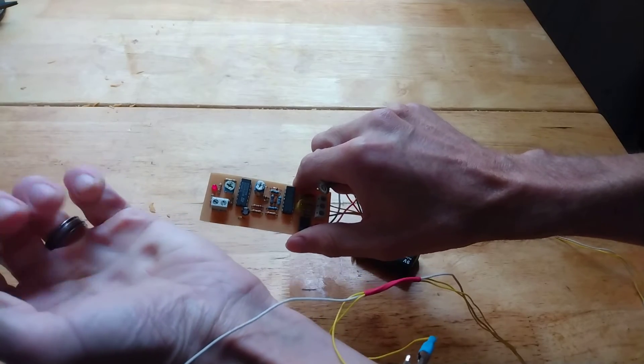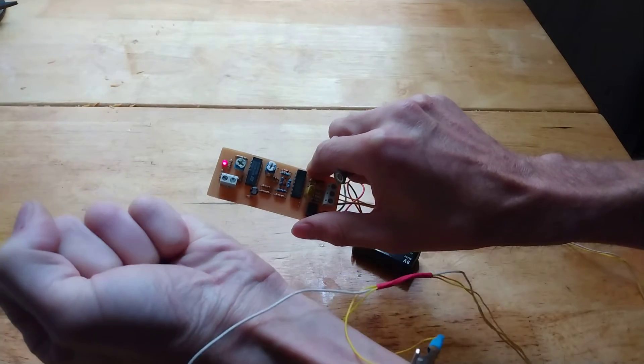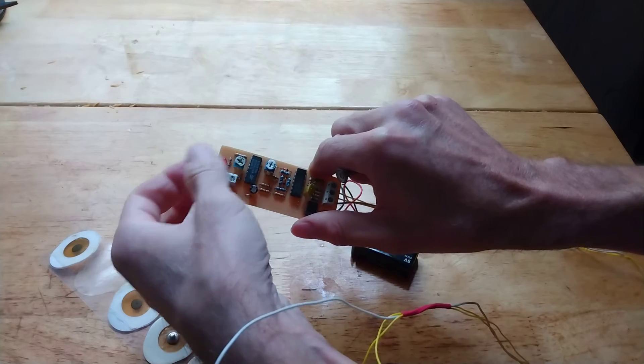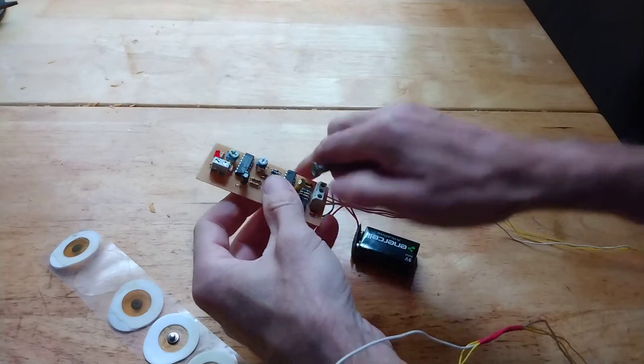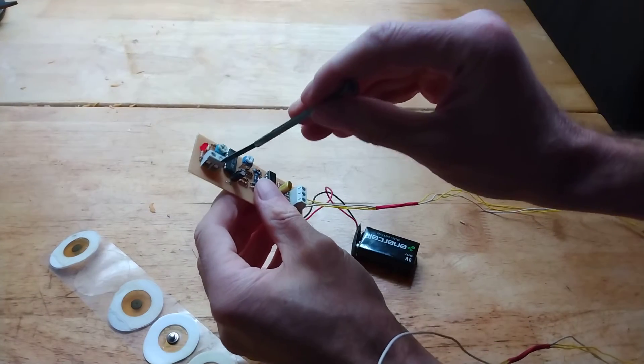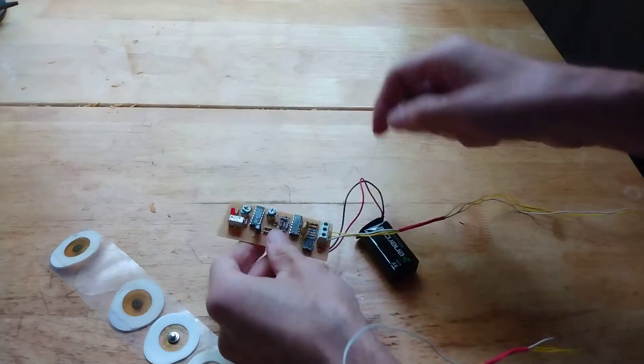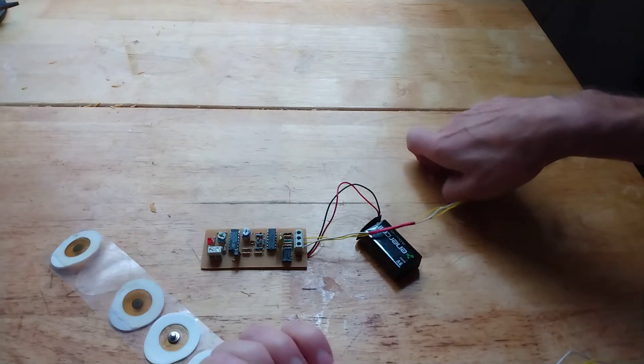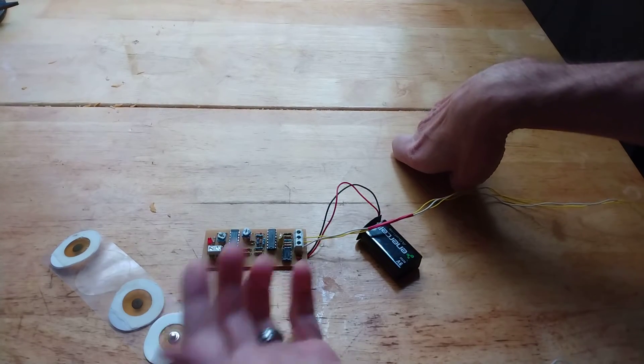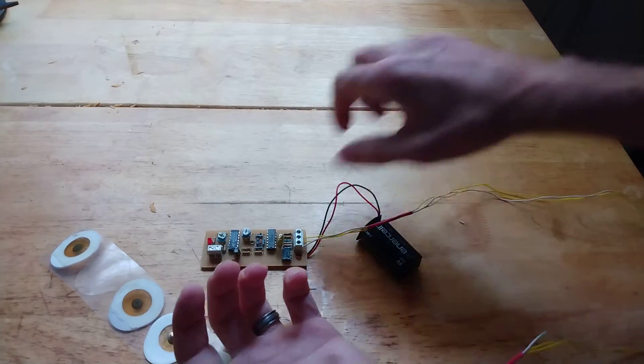And of course you want to do something else than just turning on an LED. So with this terminal block you can connect this unit to another circuit that can control, for example, a servo or whatever electronic device you want to control.